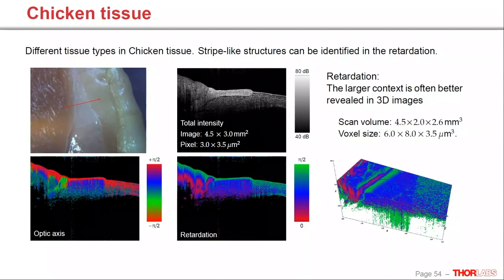Of course, this is just an easy example, and we can't really say if the polarization effects in our sample are intrinsic to the sample tissue, or if we have induced them by stressing it and cutting it up and placing it on our sample tray to investigate it.